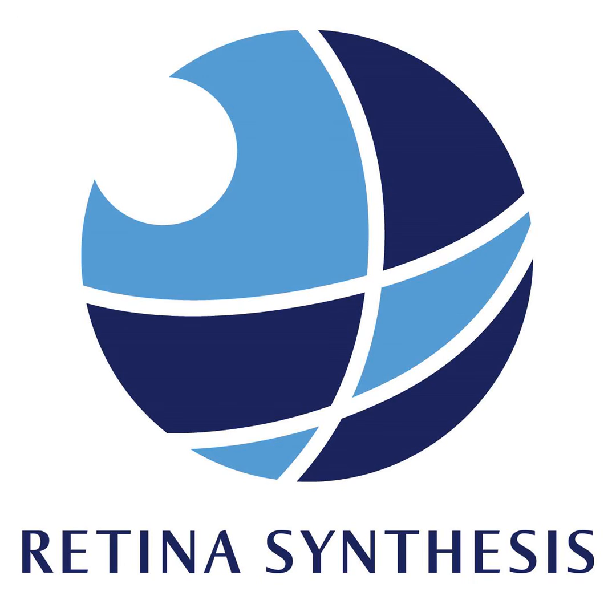And I once again want to thank Ricky Wong at the University of Washington, Seattle, because he's applied this approach that was actually developed in DeBoer's group. It's called optical attenuation coefficient imaging using OCT. And the optical attenuation coefficient is just another way of referring to a particular structure on OCT that has a significant amount of reflectivity. And what we know about these retinal pigment epithelium cells, when they leave the RPE, they appear as hyperreflective dots in the outer retina and along the RPE, and you can use that hyperreflectivity using this optical attenuation coefficient approach to really light up these areas with high reflectivity.